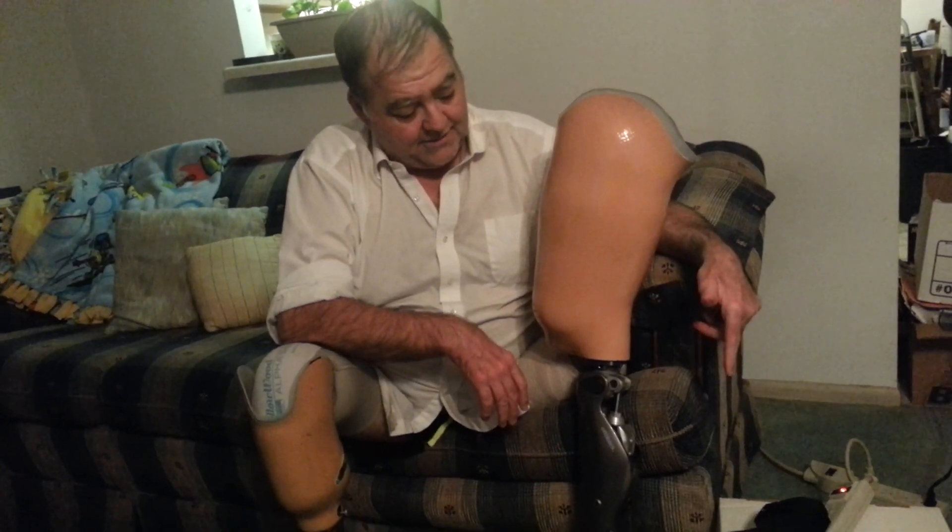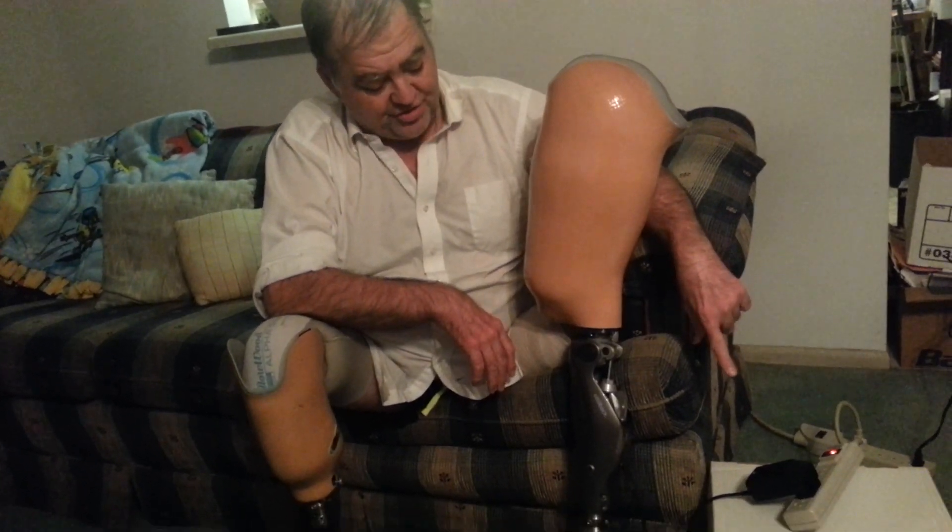According to the directions I found, the charger can be left plugged in all the time, whether the prosthesis is plugged in or not. So if you're plugging and unplugging this thing every day, you can leave the charger plugged in.